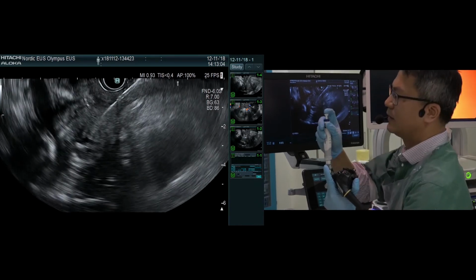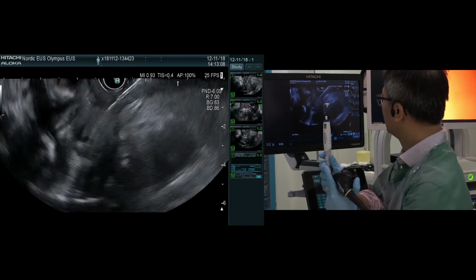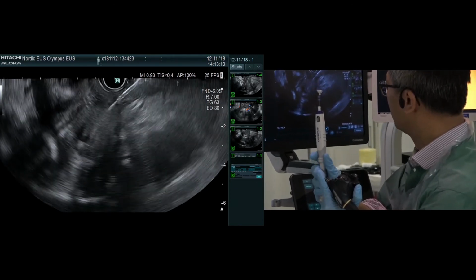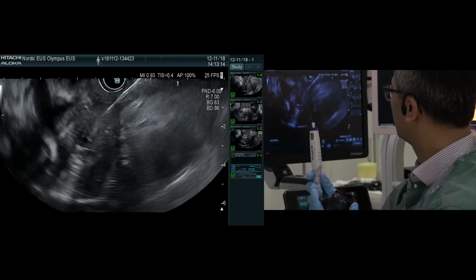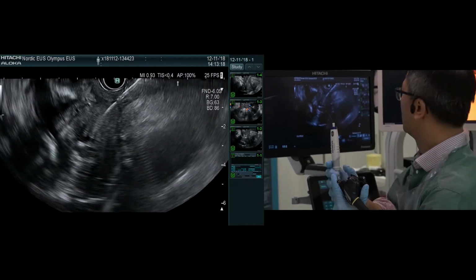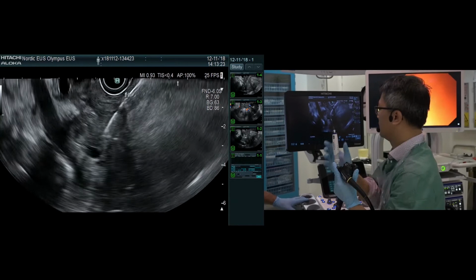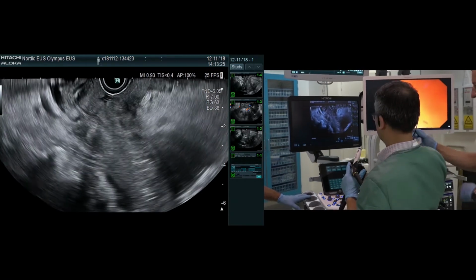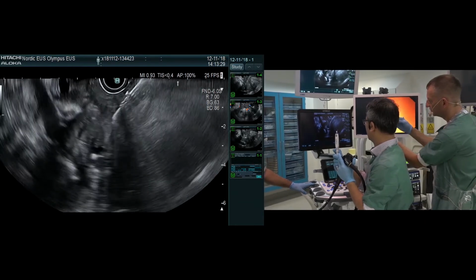Okay, so I'm in, I push out the stylet, and then I try to move the needle back and forth a few times, make a slow suction here. Slow. And try to fan it a bit. Perhaps could you help me with this? Yes, sure. You want to slowly, you can just pull.